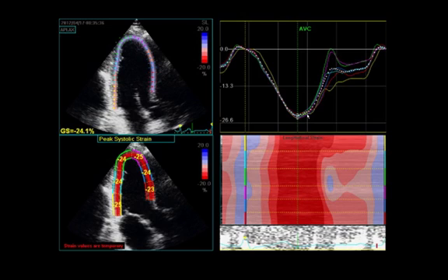We have the ability, but like I've said here, if it's requested, we do it. We don't do it on everybody. We just do it when it comes requested, like I showed in the form. But we could potentially do it routinely. We have conquered the learning curve, and all of my 11 echo techs do it, and they do it very well, and so I'm very happy with that. I think we're going to pick that up. We can probably just increase that to the next steps.